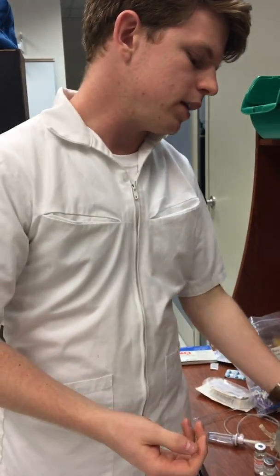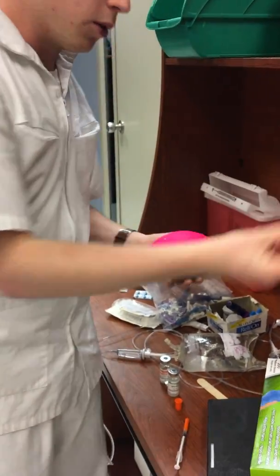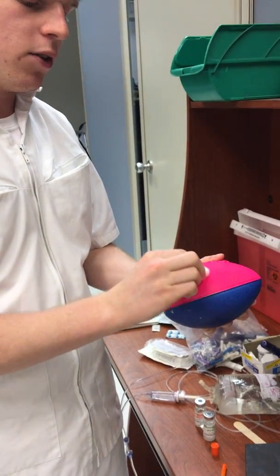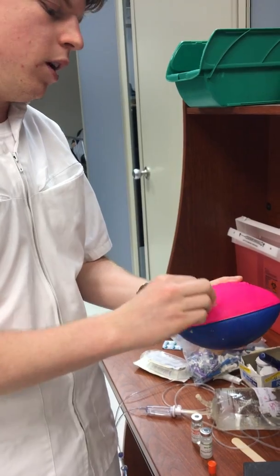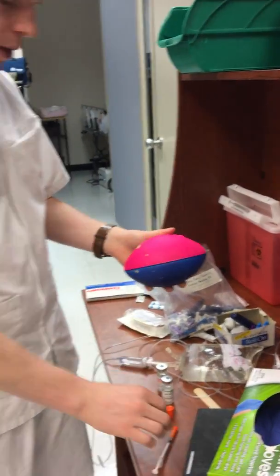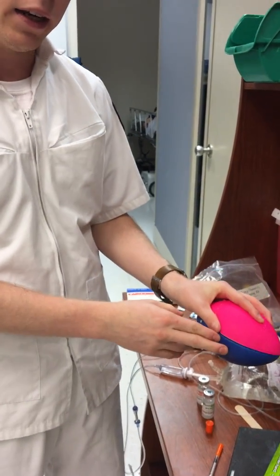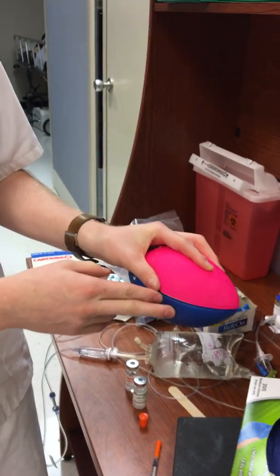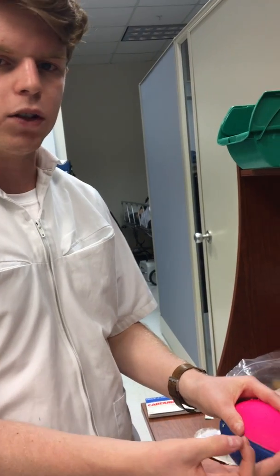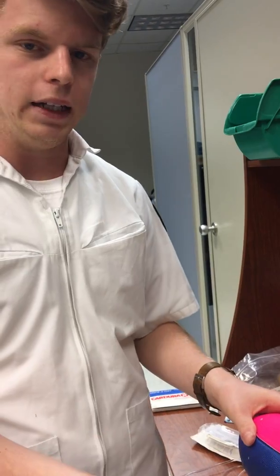So what I would do then is choose my site, and this is going to be the abdomen. I would take my alcohol prep again, and I would clean the site using a circular motion moving outward, and I would let that air dry. And then I would take my insulin syringe and pinch up as much skin as I can. That way I can get the subcutaneous tissue. If I can pinch up about 1 inch, then I would need to inject at a 45-degree angle. If I can pinch up 2 inches, then I could do a 90-degree angle.